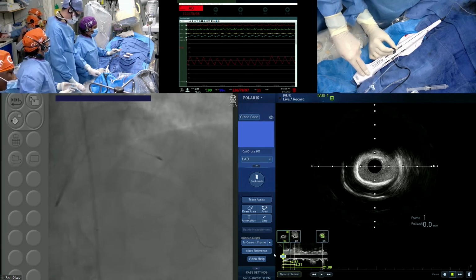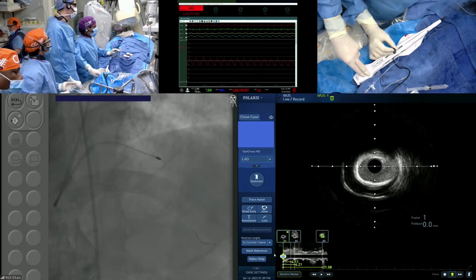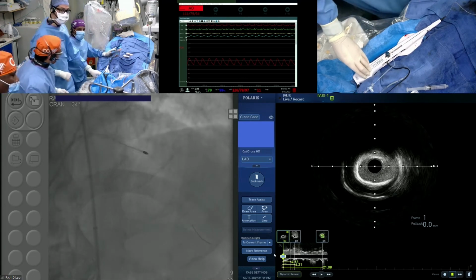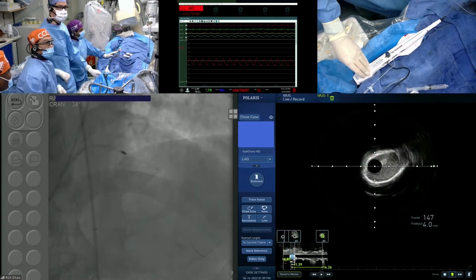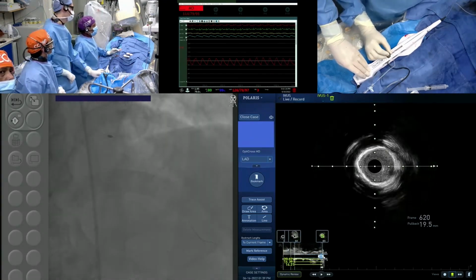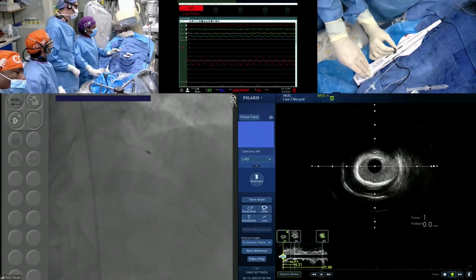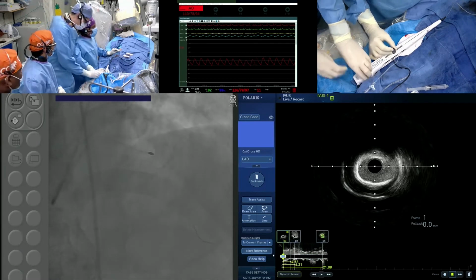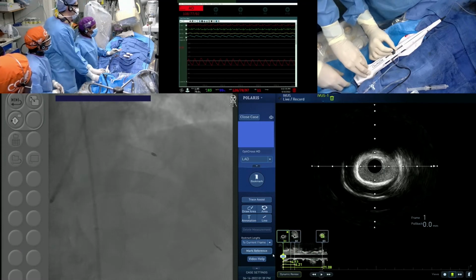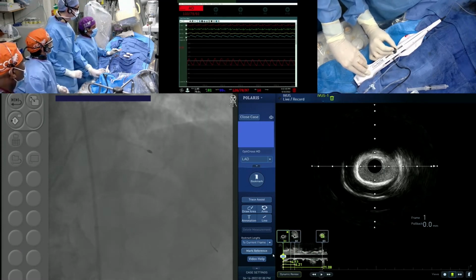I think this is very, very good technique crossing. It went all the way, pretty stable, I'd say. And for anybody who had doubts regarding whether this case required a rotablator, the difficulty with which the burr is advancing, I think this makes the point very clearly. This is severely diffuse disease all over. Just for the crowd, it's an interesting point that you didn't hear the burr noises.